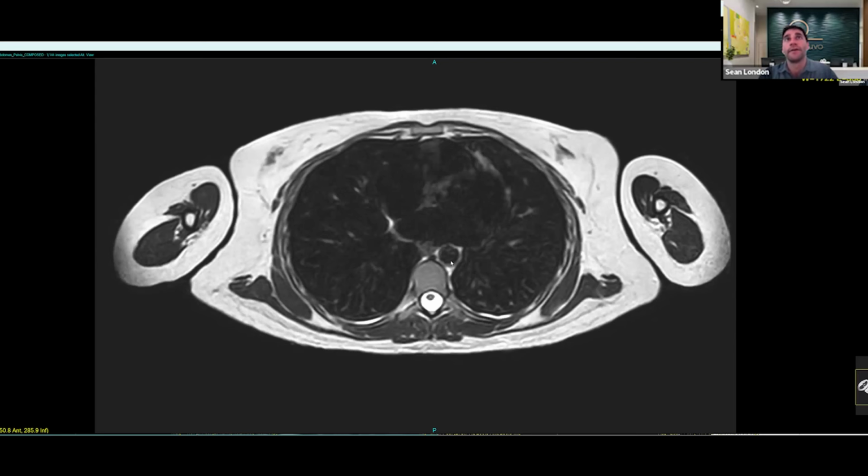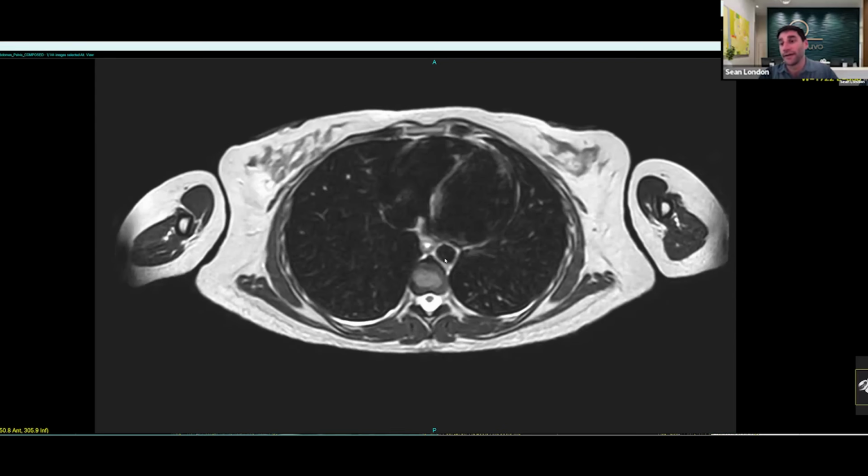If I saw this as bright white, that would be very concerning to me as a potential blockage, and that would be really significant, by the way. But we also have to be very careful because MRI of vessels is prone to artifact, particularly when not using contrast or dedicated techniques like we did in the brain for that MRA. So overall, if you have concerns about your vessels, it's best to do dedicated imaging. Dedicated CT typically, right? CT is great because it's quick, and the anatomic detail is exceptional. Even calcification is picked up really nicely on CT, whereas we have trouble visualizing calcification.